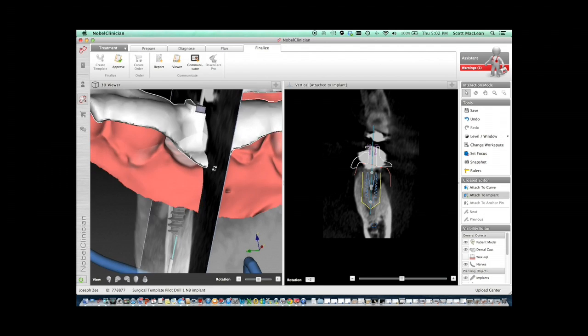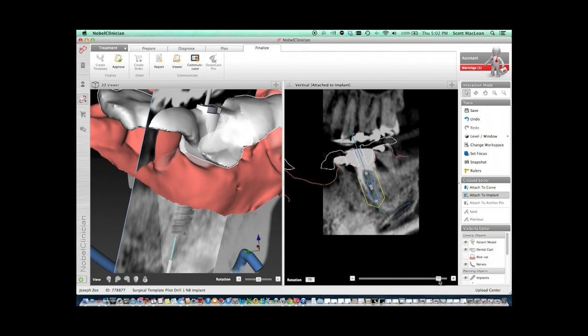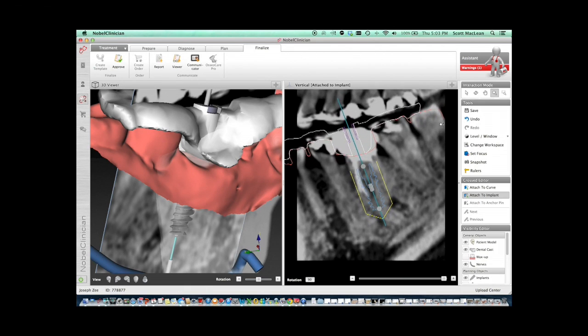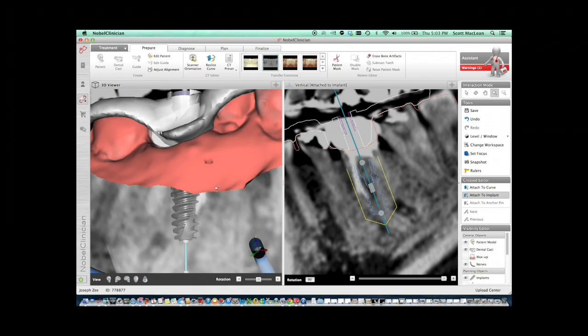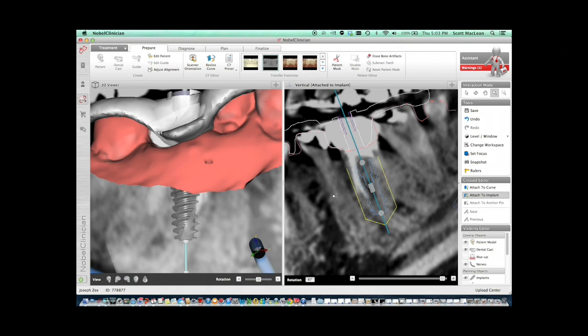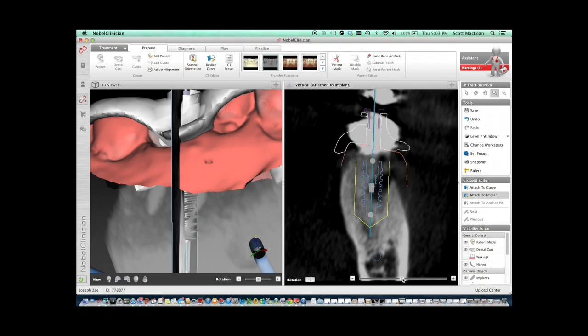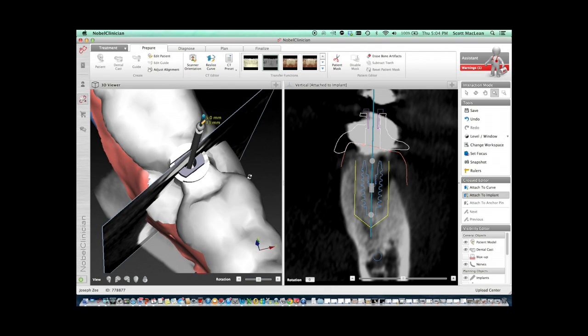Once we have the Smart Fusion done, you can see a blend of the CT and the actual scan model. This will enable us to envision where the soft tissues are, which is critical for planning this case, because we want to place this implant a minimum of 3mm below the free gingival margin. We can see exactly whether we're going to be close to the nerve, what the angle is going to be like, and where we want to place this implant — because doing this freehand is possible, but we want to be particularly accurate so it's not going to slip off to one side or be in a position that's not useful from a restorative standpoint.